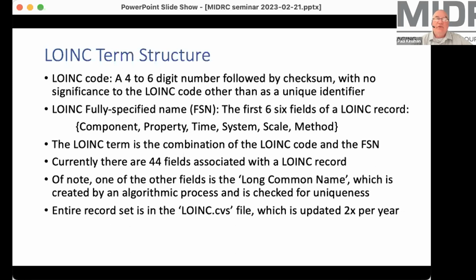So if for some reason you're looking for a code, and it does happen that there isn't one that describes things precisely like you would want, you can propose it and they will review it. And if it fits the system and it's properly justified, it'll get added to the database.